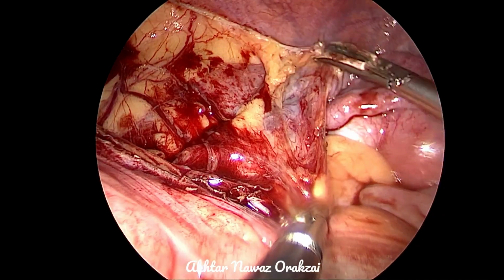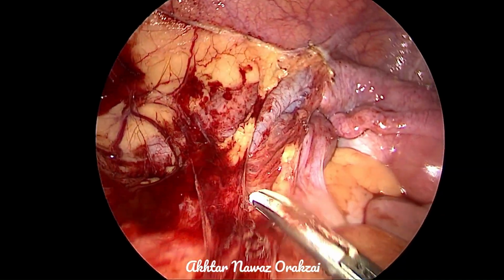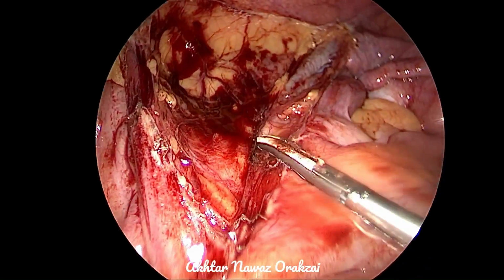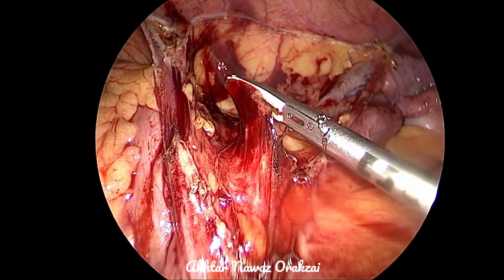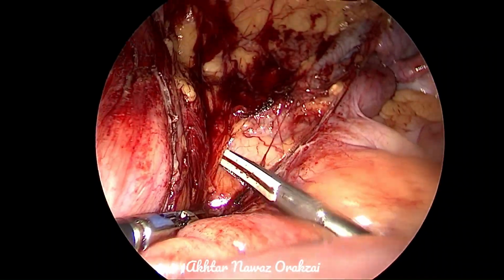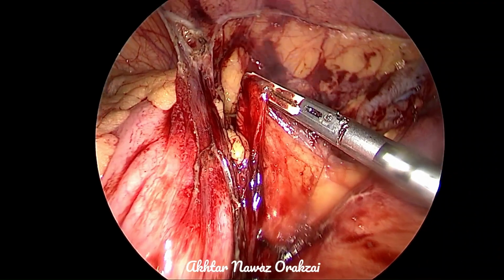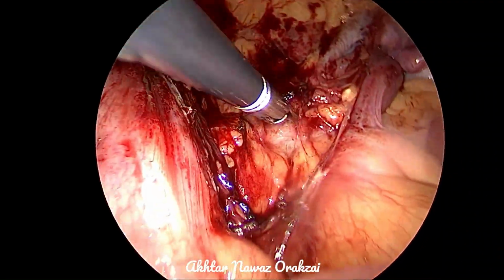So here you can see the external iliac vessel, external iliac artery, and then dissecting proximally we will go to the bifurcation of the common iliac artery into external and internal arteries, and the ureter will be crossing this bifurcation, so it will become easy.